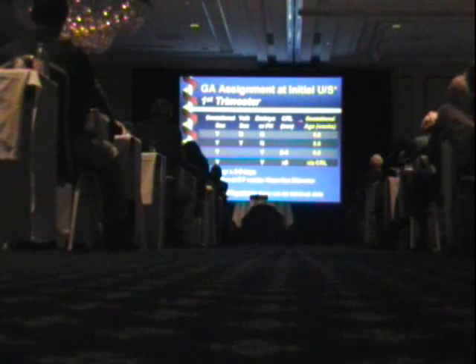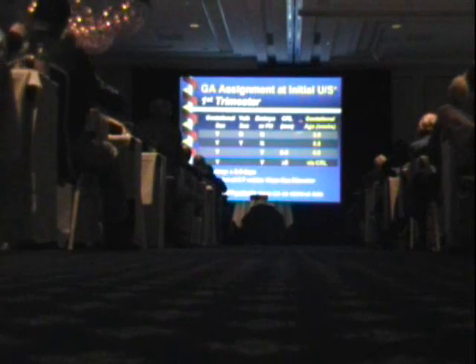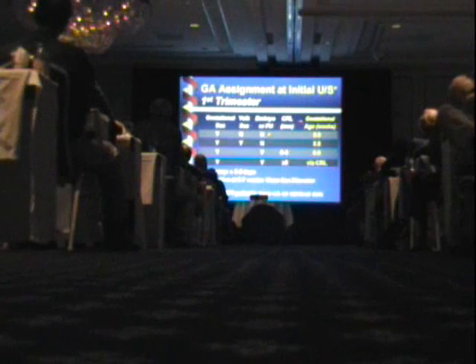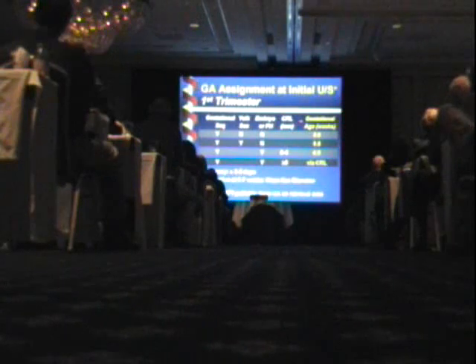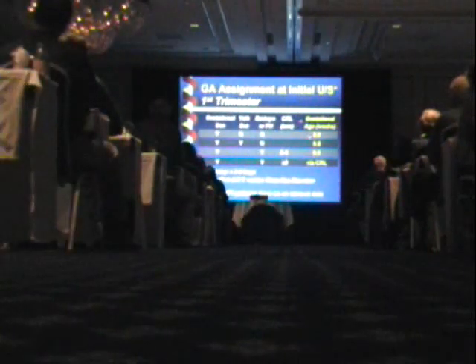If we see a gestational sac but no yolk sac, no embryo when we're scanning transvaginally, we'll say that our best estimate of gestational age is 5 weeks. Of course, that is with the proviso that since we haven't seen an embryo or a heartbeat, we're not sure there's a living ongoing pregnancy. If there is, our best estimate, based on the visualization of a gestational sac with nothing visible within it, is that it's a 5-week pregnancy.